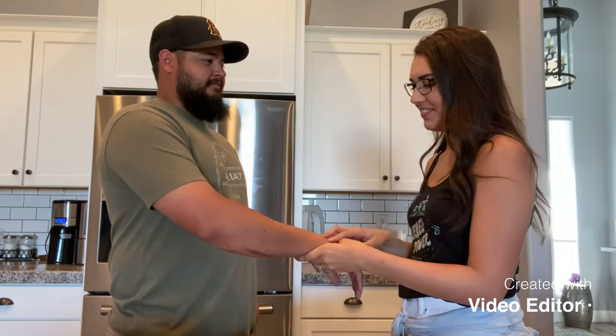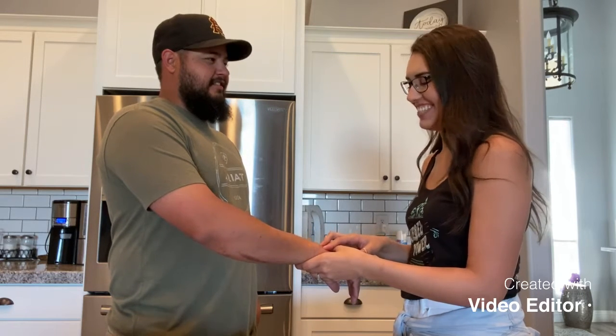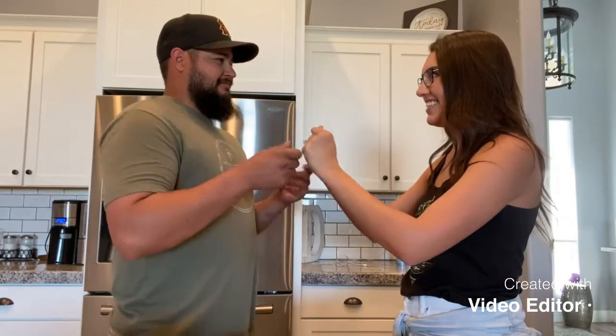Can I verify your name and date of birth? Yes. What's your name? Jared DeBruller. And your date of birth? 12/10/93. Awesome. Any chance of pregnancy? Nope. Okay, I'll have you put this gown on and remove your shoes, socks, and any jewelry that you might have on. Sounds good. Okay.